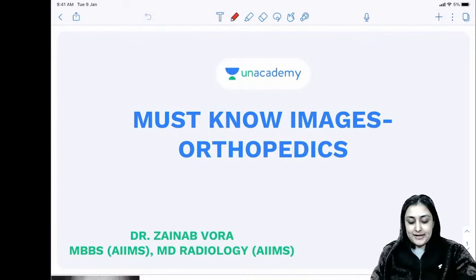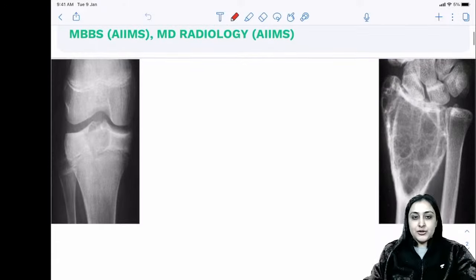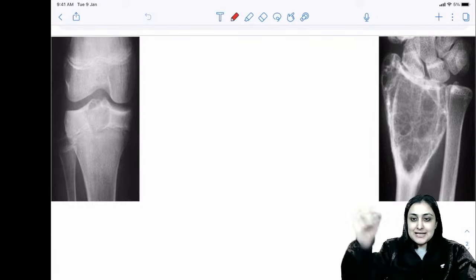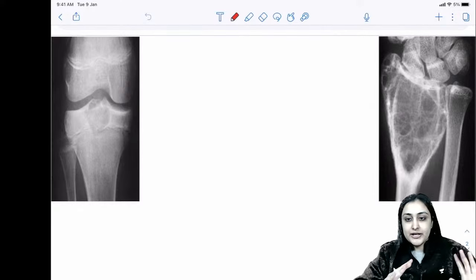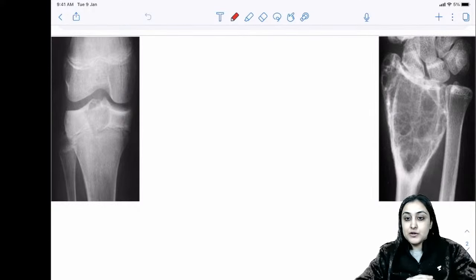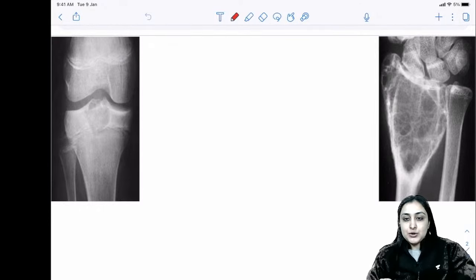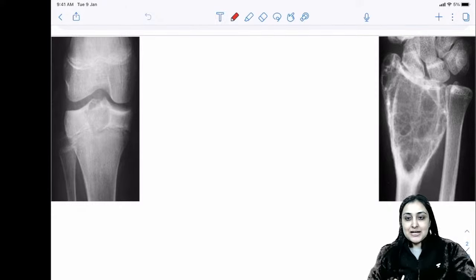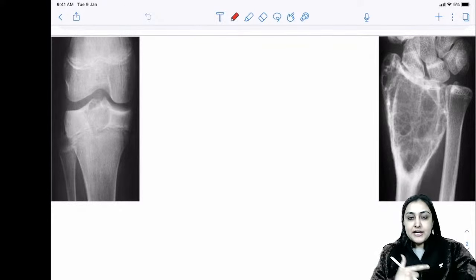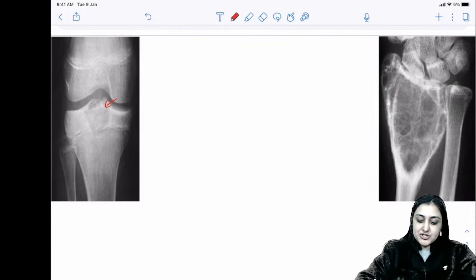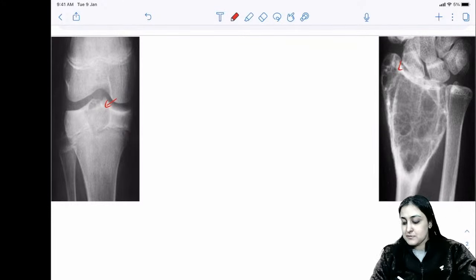Starting off with bone tumors. Anytime you look at a bone tumor case, the most important thing is the location in the long bone — is it in the epiphysis, metaphysis, or diaphysis? That is the first thing you look at. Second, look at the age of the patient, then the morphology. When the tumor is reaching the end of the bone, it is an epiphyseal tumor.